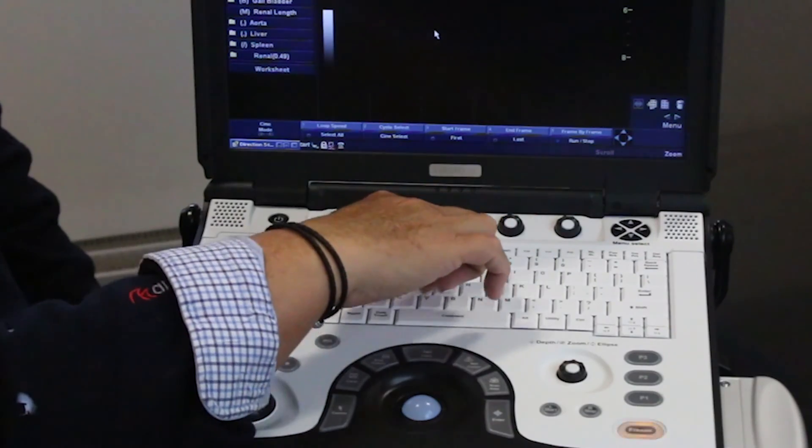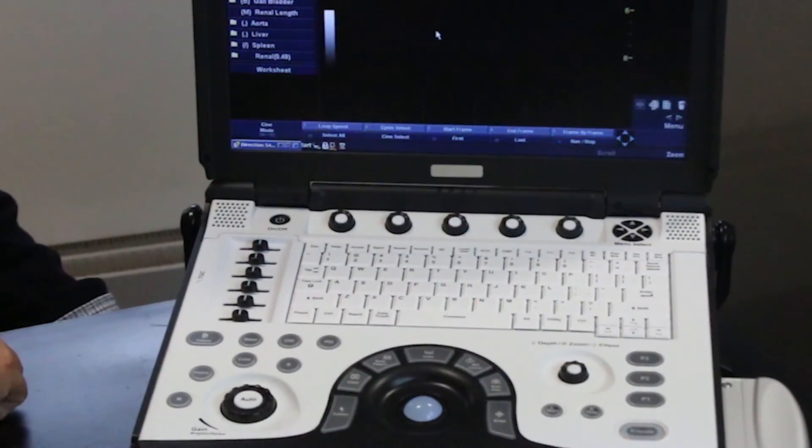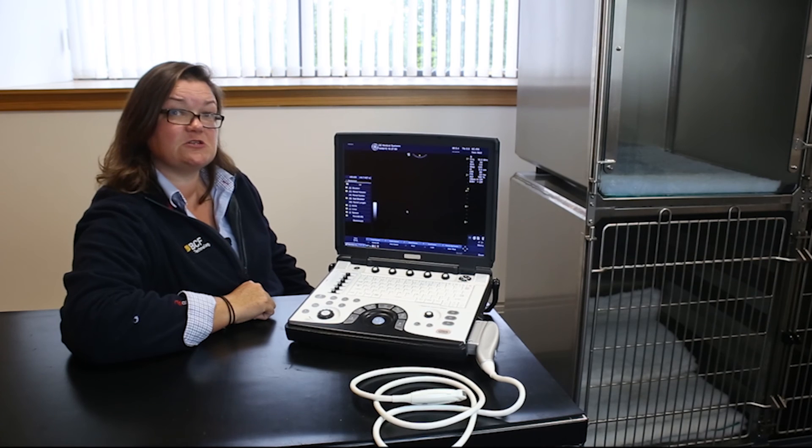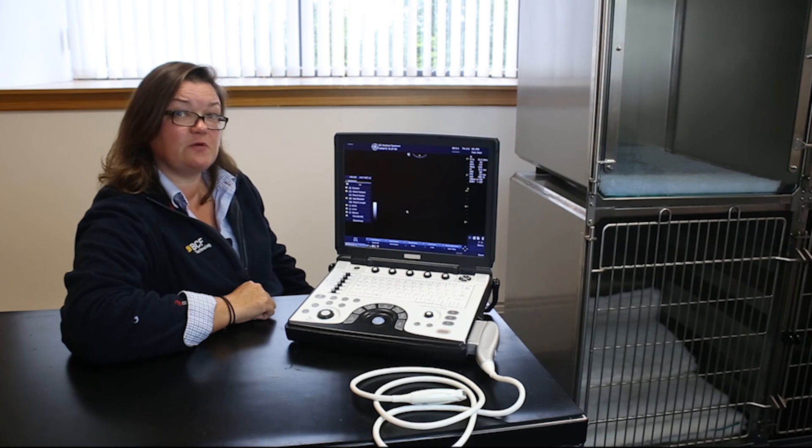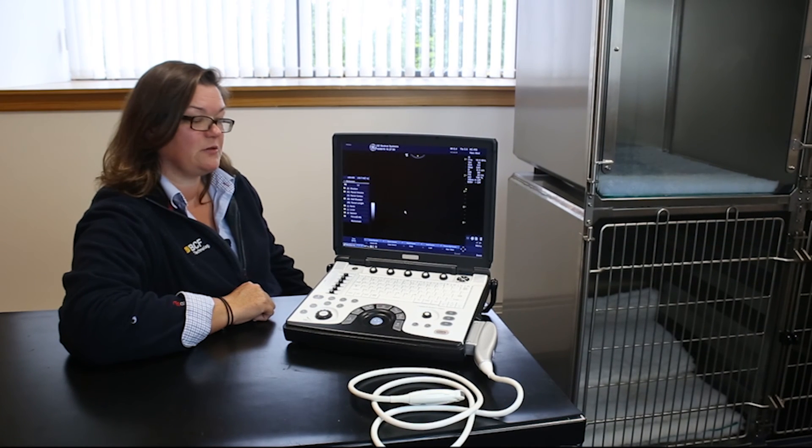These functions will all be brought into play by the function keys along the top of the alphanumeric keyboard if they're enabled on your machine.